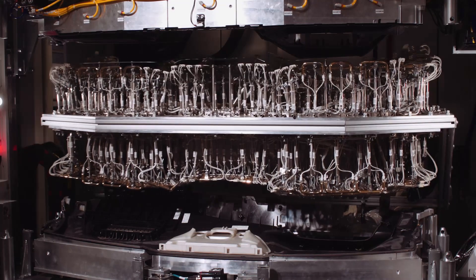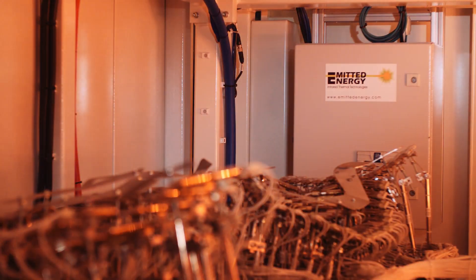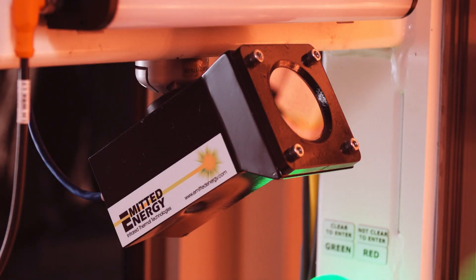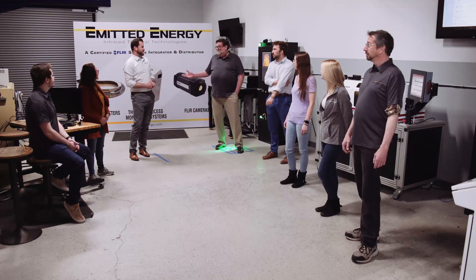Emitted Energy is an industry leader in thermal monitoring solutions with a huge track record of expertise in thermal solutions. Emitted Energy's engineering experts have put their years of thermal imaging knowledge to bear in designing a reliable and accurate testing system. At Emitted Energy, everyone on my staff is a level one or level two thermographer.